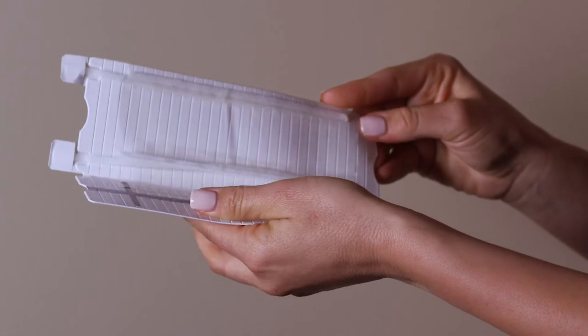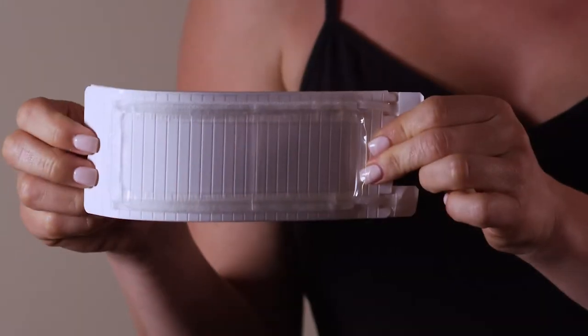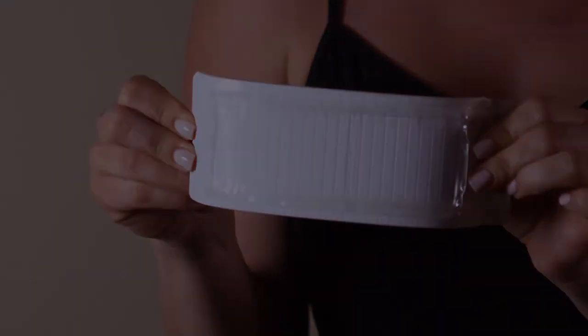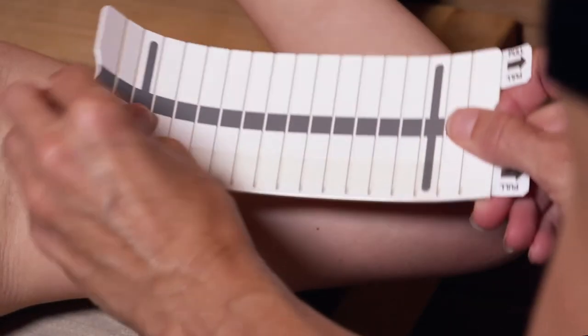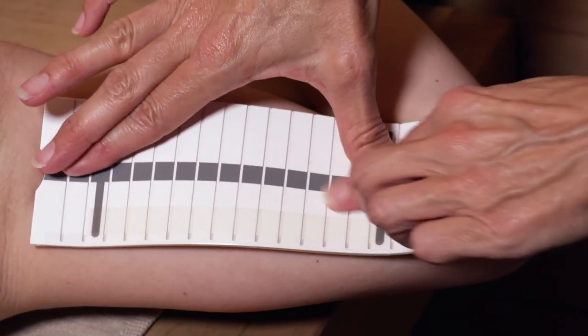Next, fold the side of the applicator with the dark stripe all the way back and gently bend the applicator. Using the dark stripe to help center the dressing over the scar, position the applicator with the dark stripe facing away from your body.